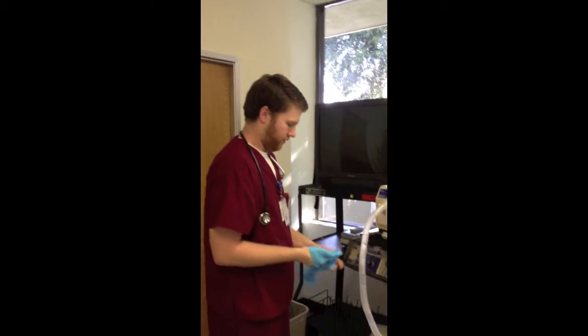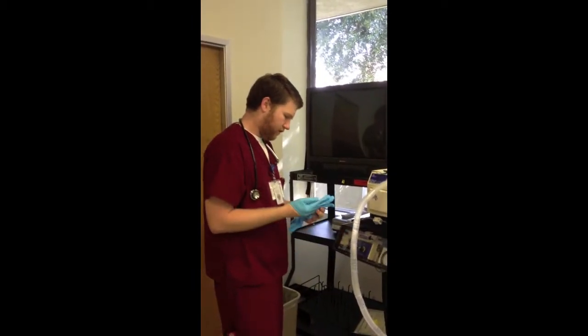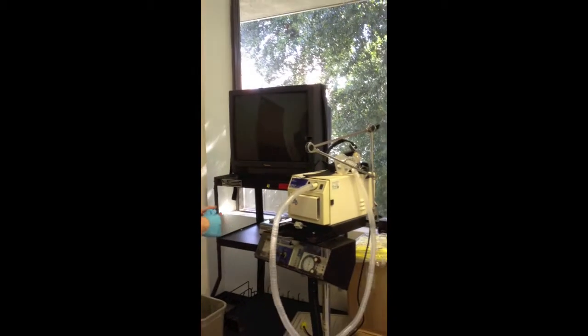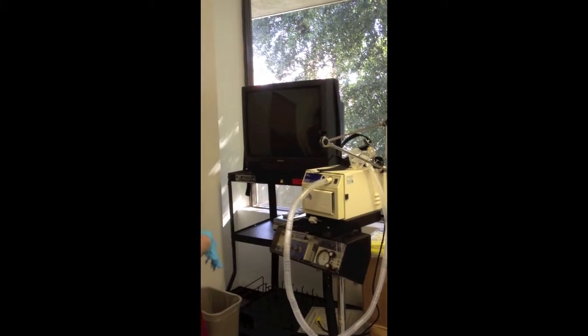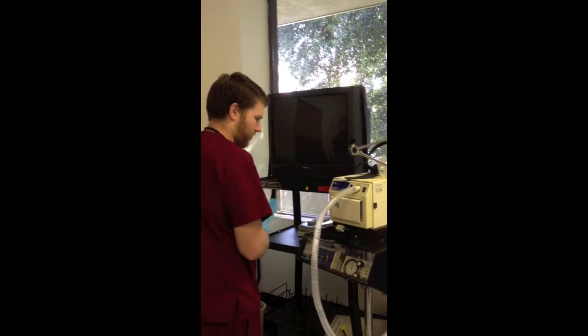The next step is to obtain and assemble the equipment, and if needed, to check to make sure the equipment is working properly. Usually the equipment is already run through a check procedure and has a sticker verifying it is in proper working order.